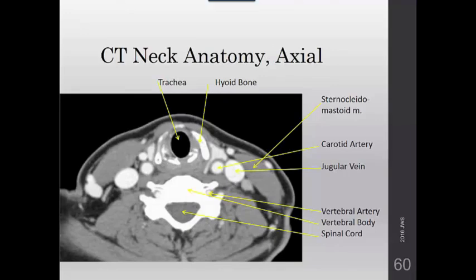Learning the anatomy of the CT neck can be a little bit overwhelming. Looking at the image, you can see that most of the posterior region of the neck is muscle, but you have all these larger glands that are located laterally and below the mandible, and then you have vessels coursing in and out of them, and highlighted things everywhere, so it's overwhelming to see all of that anatomy and think that you can learn it, but it's not impossible. It just takes a little work.